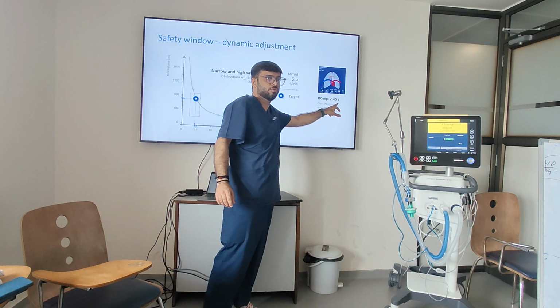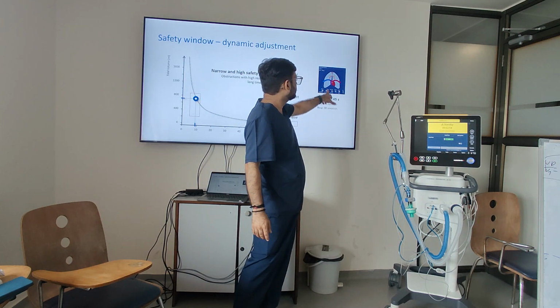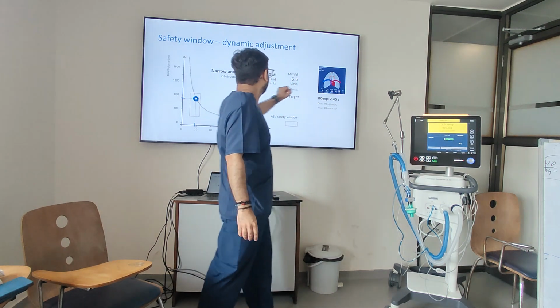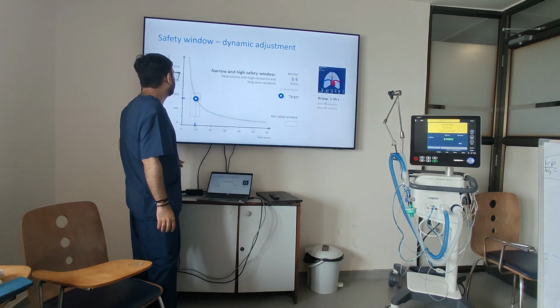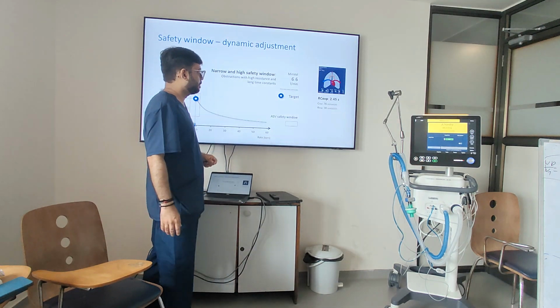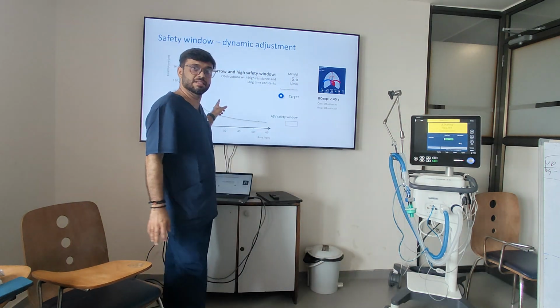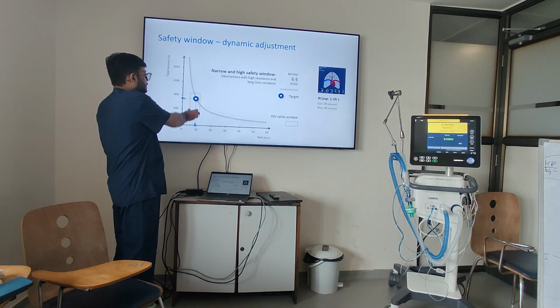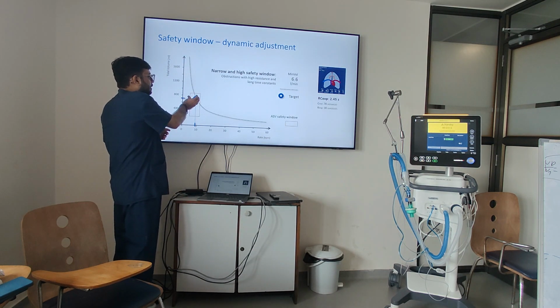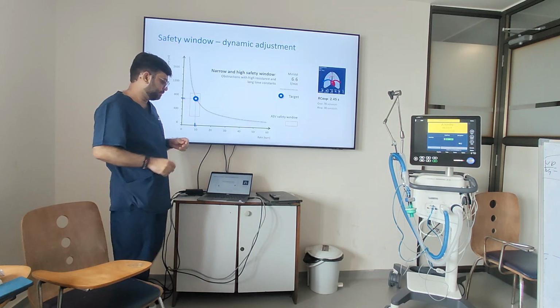The time constant is 2.45. Okay, for obstructive disease, higher compliance. If you have already seen this, with the obstruction, it will give you a vertical. You can say high or narrow. So if you have a patient whose tube is getting blocked or is coughing on the tube, you will see a graph like this. It is very prominent in the graph also. You see that it has made a wider window for volume and a shorter window for rate.